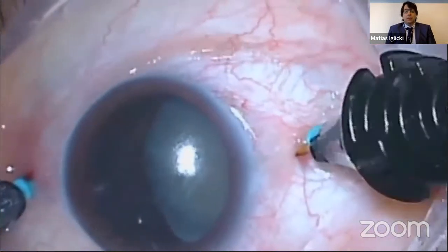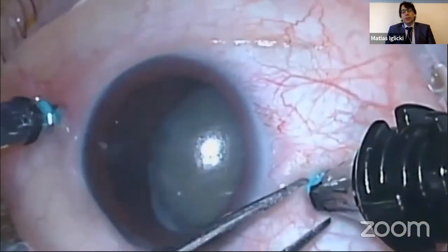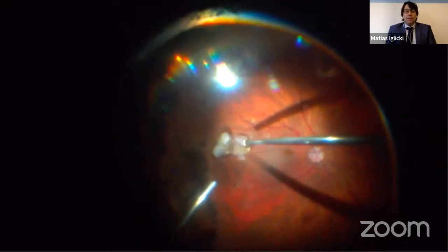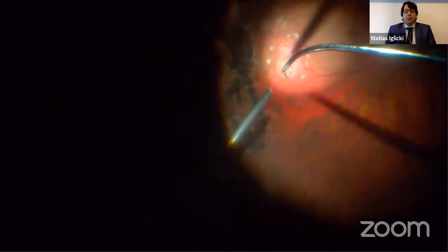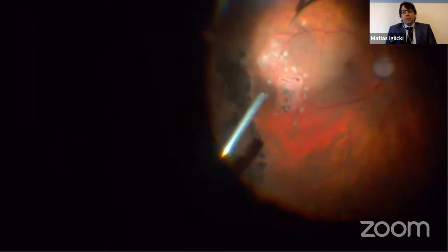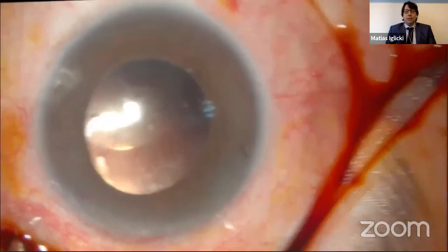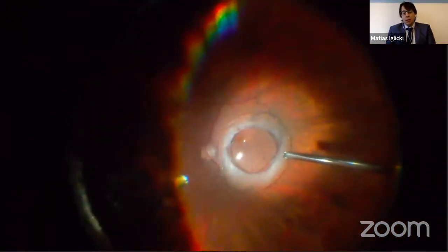This case of Marfan's, where there is no capsular support, we can use it as well. Today, we are going to focus on diabetic patients, but we can use it for every single one with no capsular support. In cases of diabetic patients operated on by our friends from anterior segment surgery, everyone knows that the complications in diabetic patients are higher, and we start to perform the vitrectomy, remove those lens remnants, and even perform laser because of the traction that our friends from the anterior segment caused when they were desperately trying to get the cataract out from the vitreous. Oh, in this case, there is the hole because of the trauma.